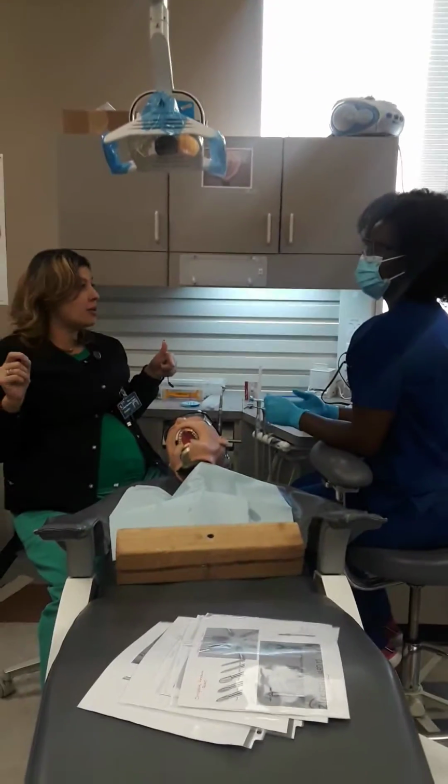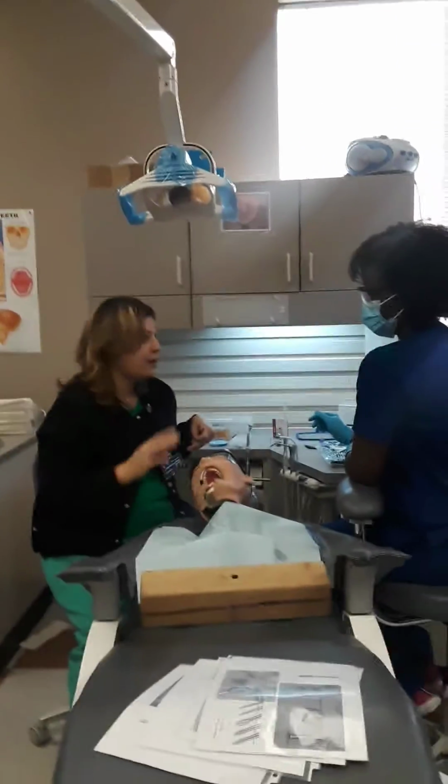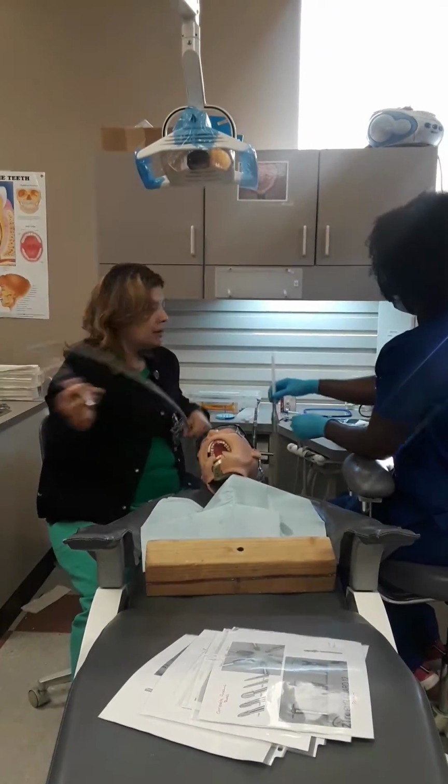One. I asked her what shade because that goes to your progress notes, and you're going to add that in your progress note. Okay, shade B1. All right, so my patient got numb. She took her shade. We waited for the time to get numb, and now it's time for a high-speed bur.